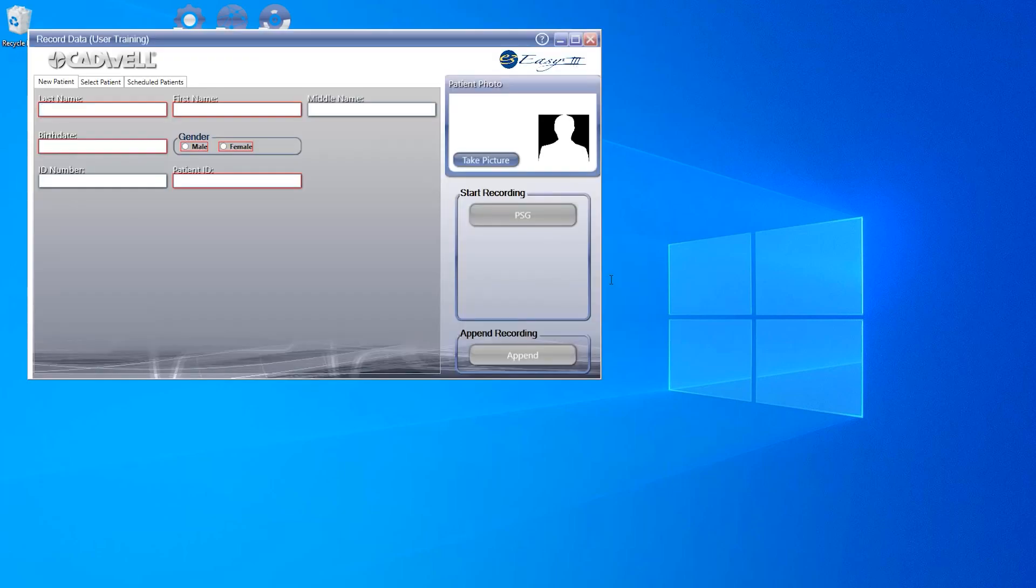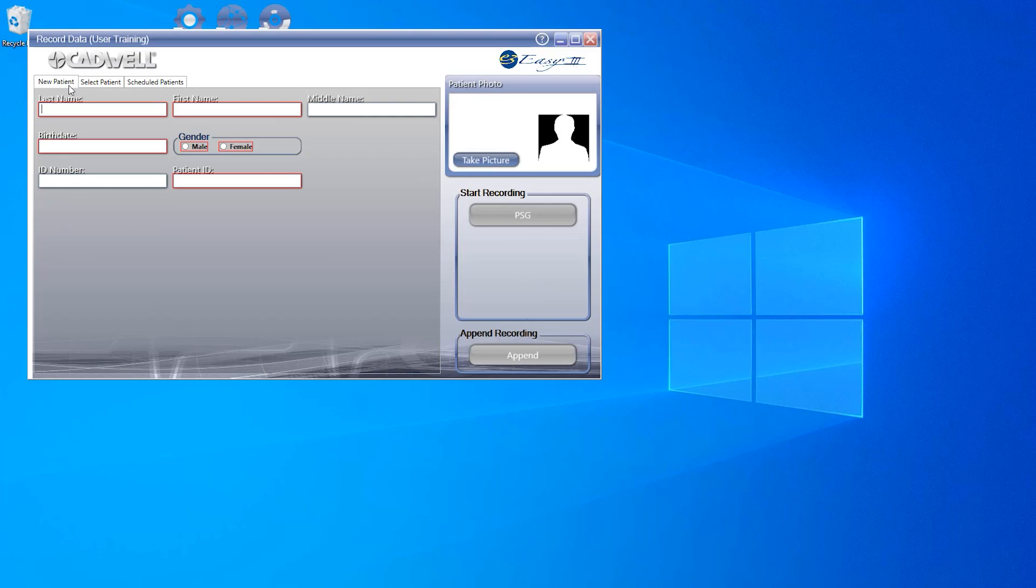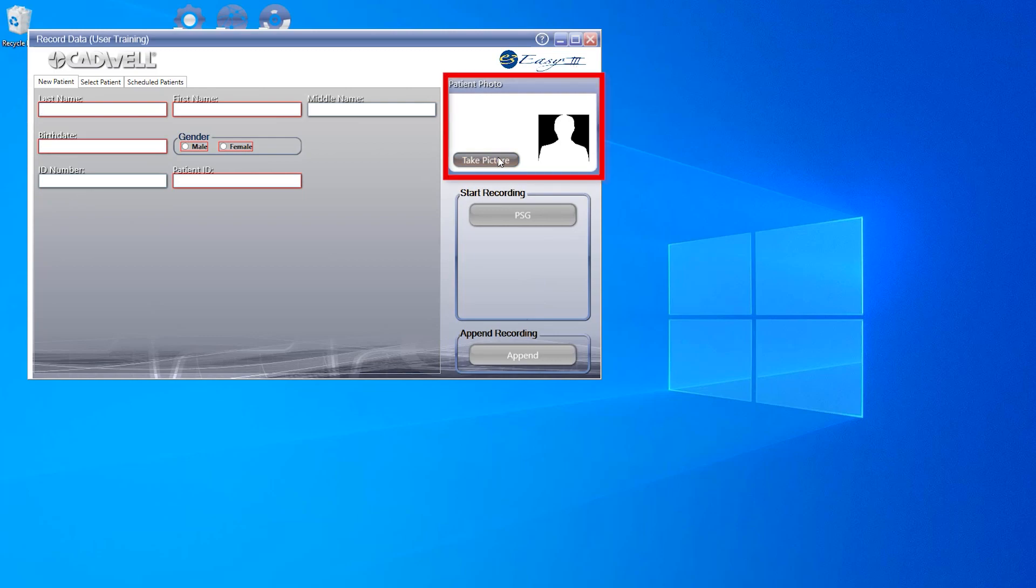Now that the dashboard is open, let's walk through what's available on the screen. First you may see up to three tabs across the top: New Patient, Select Patient, and Scheduled Patients. We'll get into more detail with these in just a bit. You will also see that with the dashboard open, you have the ability to take a photo of your patient before starting your study.